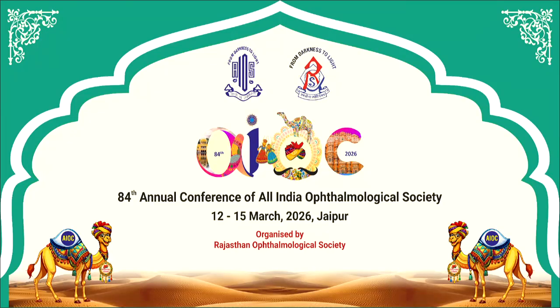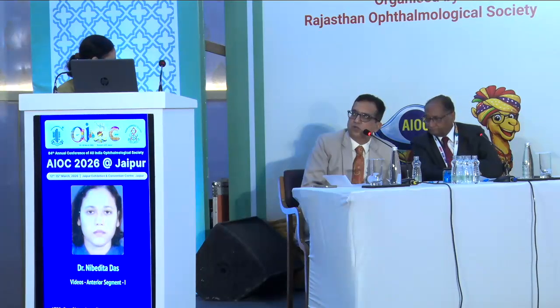So this patient came from a distant place. I told the patient that we may need corneal transplantation along with these procedures, but they were not ready for the transplant. So I took a chance, and I took all precautions during the surgery by giving endothelial protection, and I told them that after the surgery we may need another transplant. But the vision is good, so the transplant is not required. I'll be very cautious in keeping a BCL there for a long time. Yeah, I have kept it for 2 weeks, sir. After that, I have removed it.